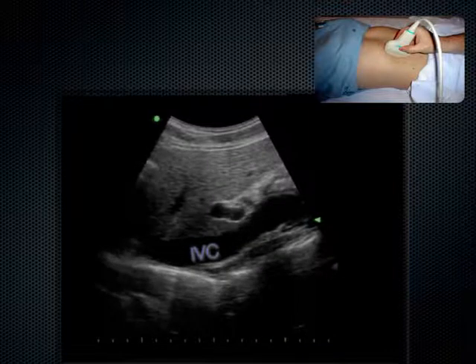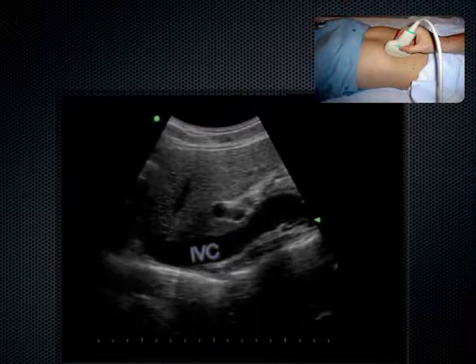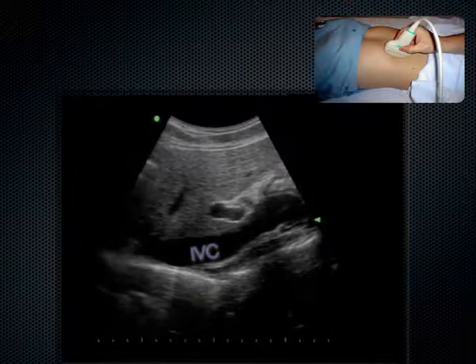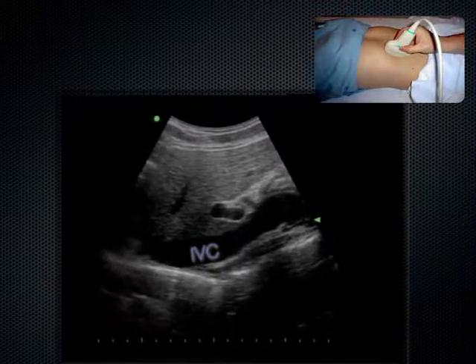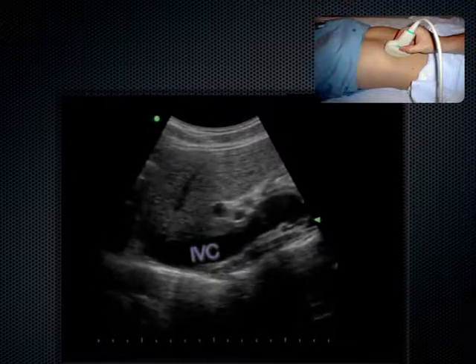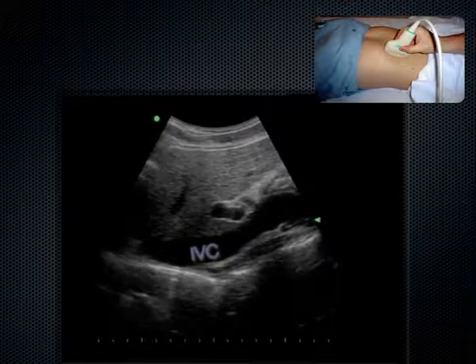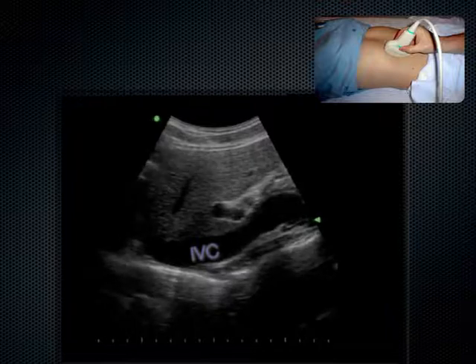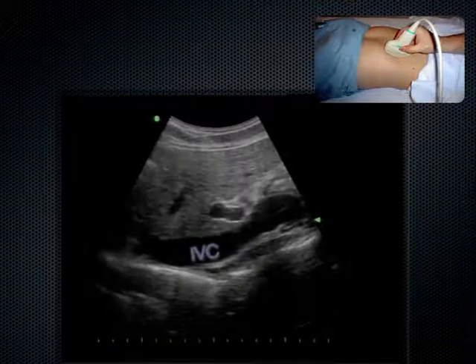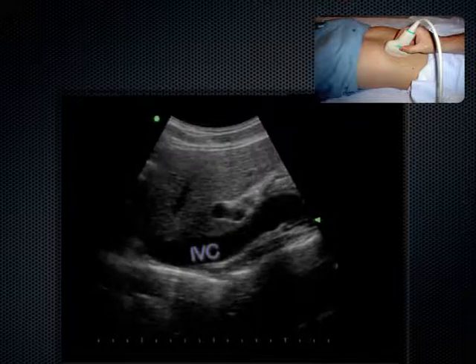And in the setting when you're trying to resuscitate somebody, it's just one more piece of data. In a plethoric IVC, what could be going on? They could have fluid overload, or they could have a blockage in a pulmonary artery, like with a pulmonary embolism. So it's just something to keep in mind in your algorithm while you're resuscitating somebody. If I have somebody who's got a lot of respiratory distress, I'm debating between a PE and pulmonary edema, and this is something that would lean me towards either one of those diagnoses.